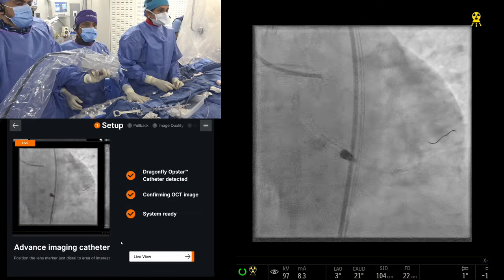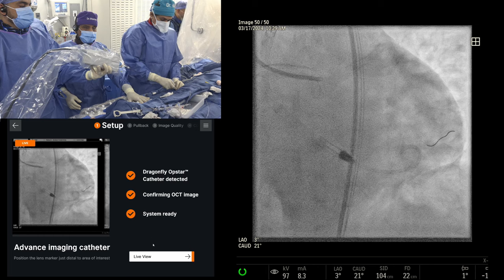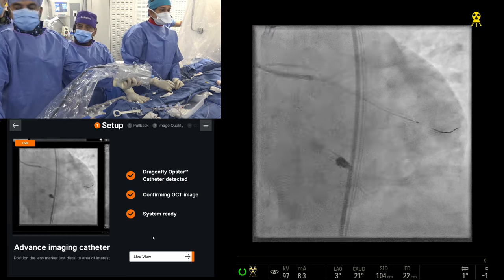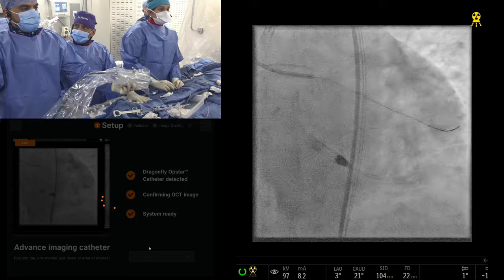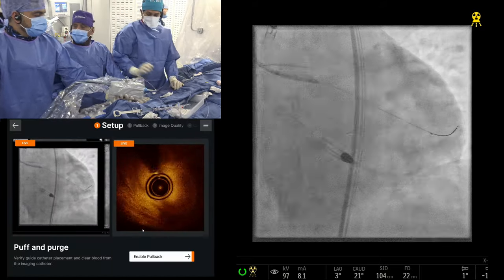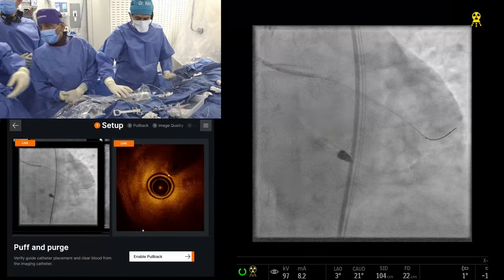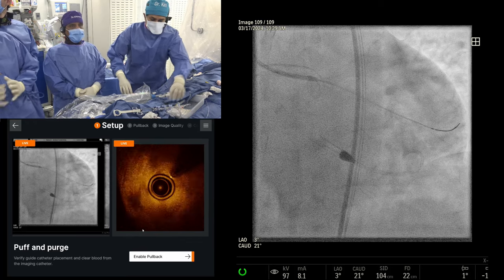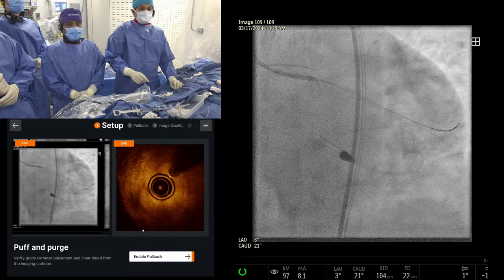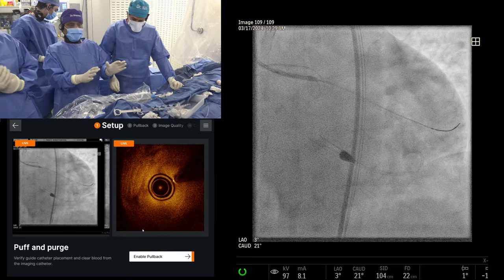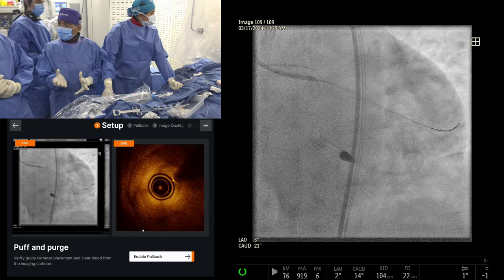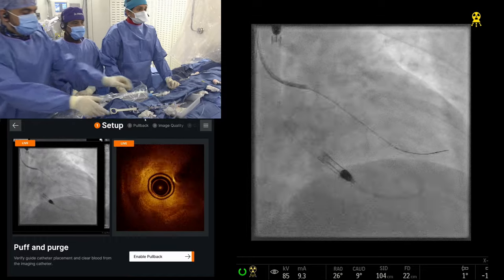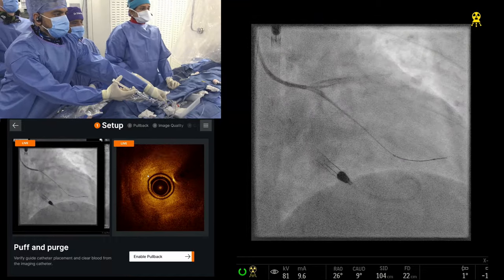A quick comment on hemodynamics: the patient has an Impella and there's no right heart cath. I like to use a right heart cath on all of these. But if you're not going to use it, at a minimum do an EDP — Dr. Kenny mentioned the EDP was 20. For optimal pump performance you want EDP about 15-20, so that's a good spot. Many patients are NPO and dehydrated — if your EDP is only 2 or 3, give that patient fluid, otherwise you'll get suction alarms.